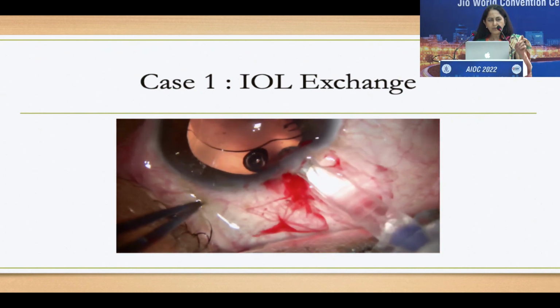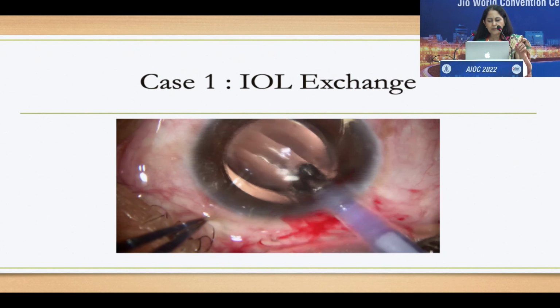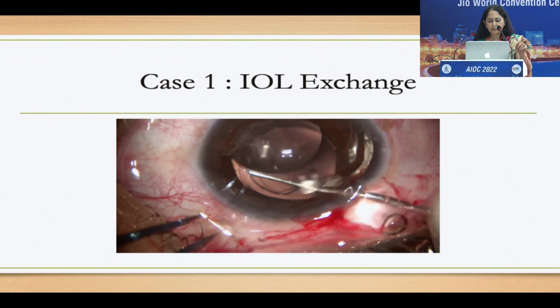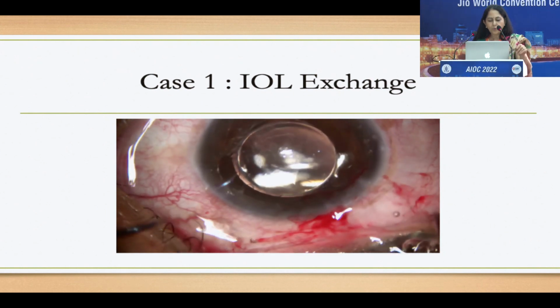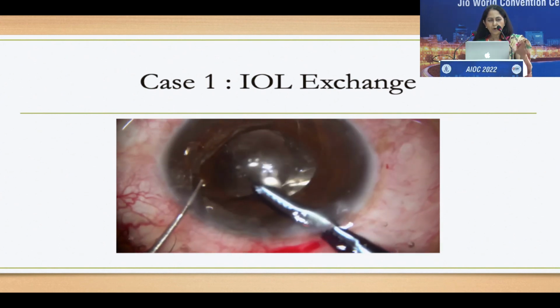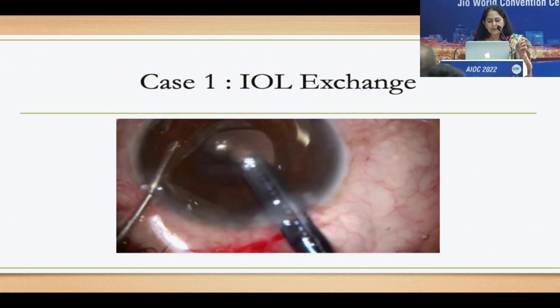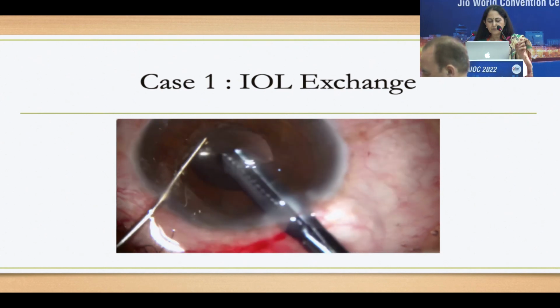And the technique which I do is the scaffold technique. Once I've placed it onto the anterior capsule, I put the intended IOL inside the bag. It's easy to dial it in. Once you've dialed it in very gradually under this lens which needs to be exchanged, now you're at least sure that your posterior capsule is well guarded. Put in more viscoelastic, and with this cutter, with your left hand or non-dominant hand, you support the lens and then you cut the lens with the main port. You can cut it into smaller bits and gently take out the lens. If you feel that the second piece is a little bigger, you can recut it and it comes out very easily.